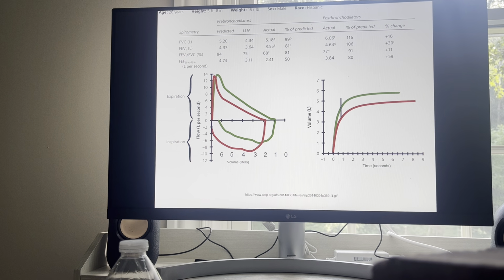When we have our growth spurt of puberty, we have an increase in lung volume, and then throughout adulthood, that gradually diminishes. Sex: males on average have larger lung volumes than females, and so for spirometry, given we want the most accurate results, we use the birth sex. Height: taller people have larger lung volumes. But again, we want the most accurate results, so don't rely on the patient's stated height. This is a time to actually measure their height in the clinic and then perform the spirometry.